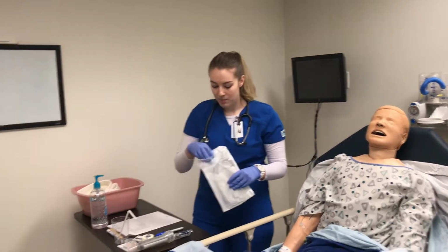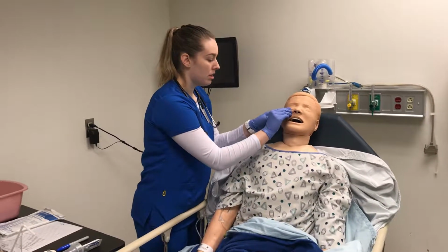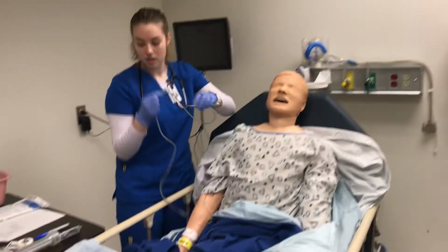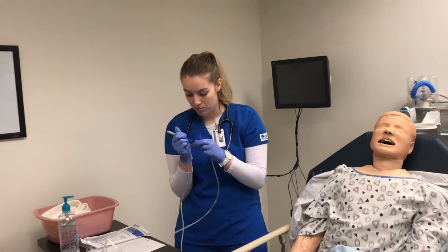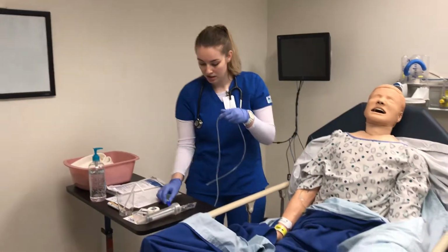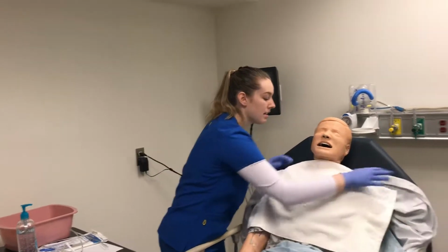Okay, Shirley, so I just have to measure the tube to know how far I have to insert it. So I'm going to go from the tip of the nose to the earlobe, and then down to the xiphoid process. Okay? And then I can take my marker and put a mark on where I need to insert it to.